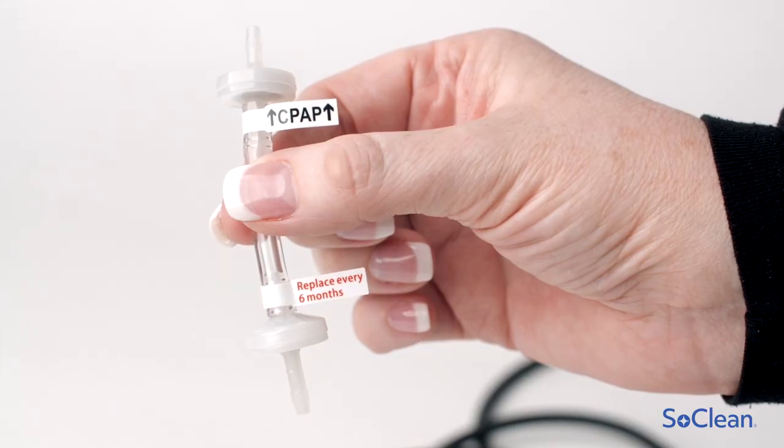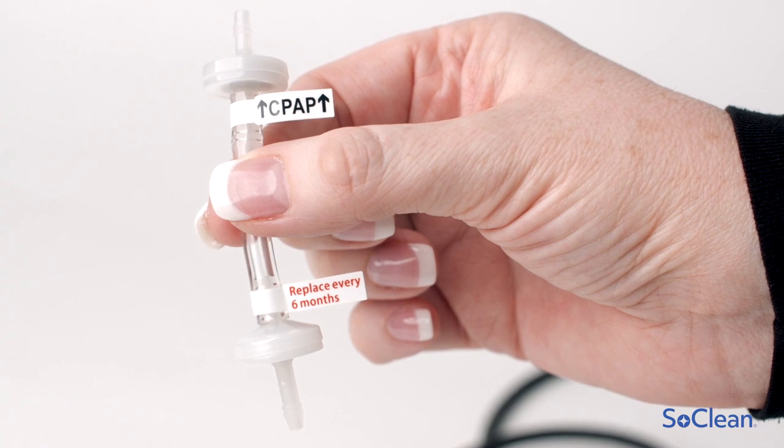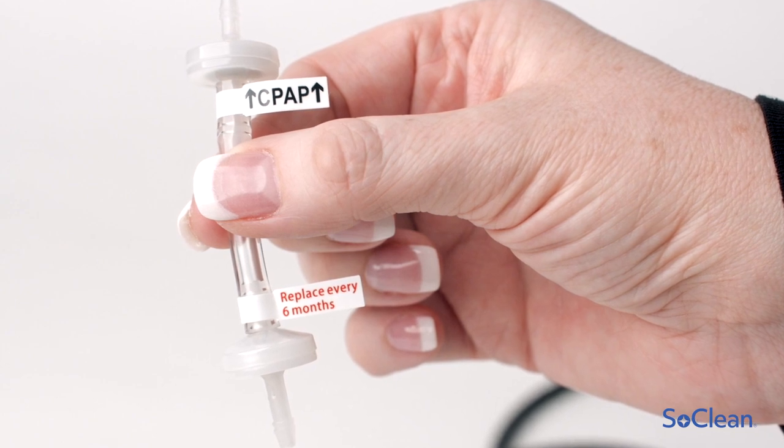The direction of your new check valve is critical. Your SoClean will not work if it is installed facing the wrong direction. The end of your new check valve has a label with two arrows that should be pointing towards your equipment.